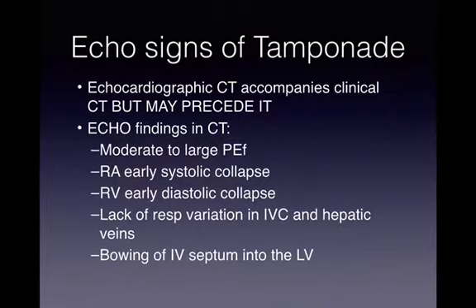So what signs do we look for on ultrasound for tamponade? These echocardiographic signs accompany clinical signs, but actually these may precede clinical signs of pericardial tamponade.